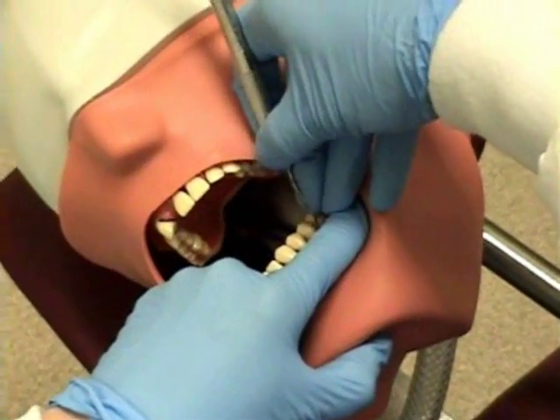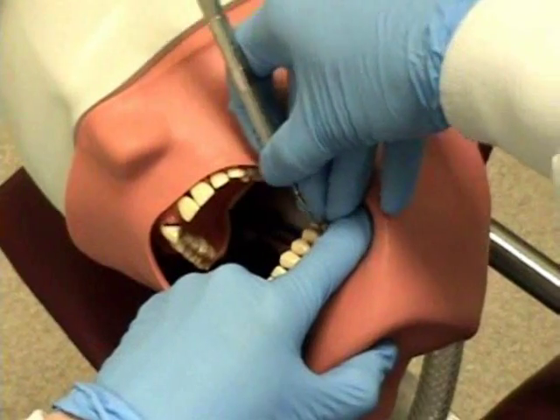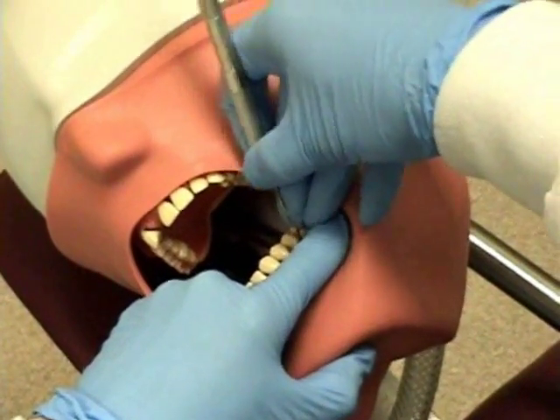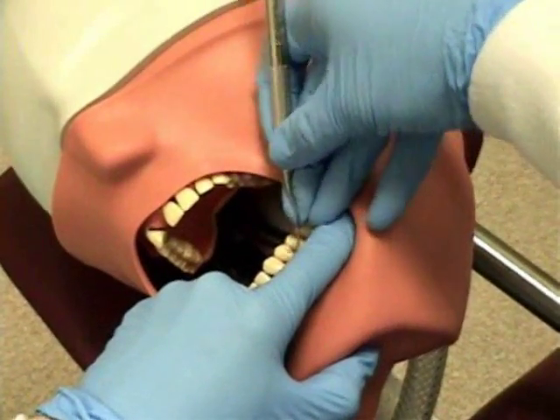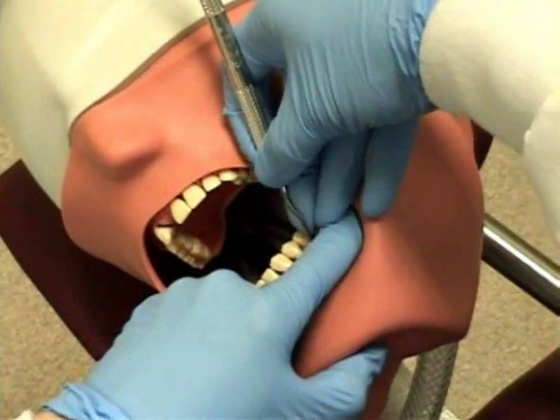In another area of the mouth, Ms. Johnson is demonstrating the finger of her non-dominant hand being used as a stable fulcrum.